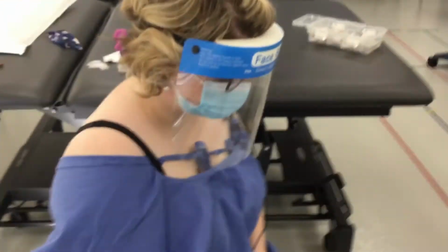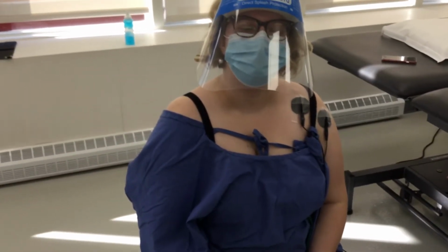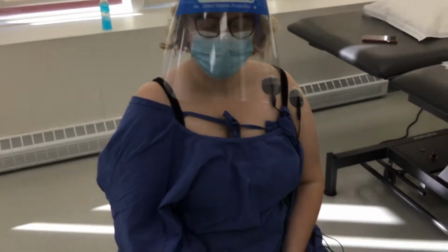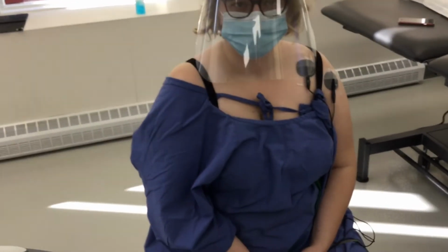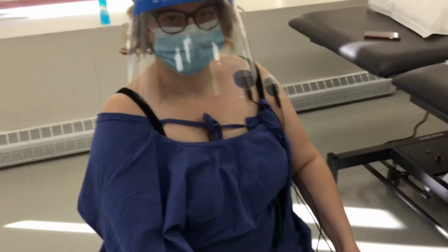Now, Layla, we're going to tell her what to expect. It's very similar to tingling. We want it to be fairly strong tingling, but it should be comfortable. Once we start it, you'll start to feel that it may be moving from place to place. Make sure that you're not going to touch the electrodes. It may feel itchy, but try not to scratch it.